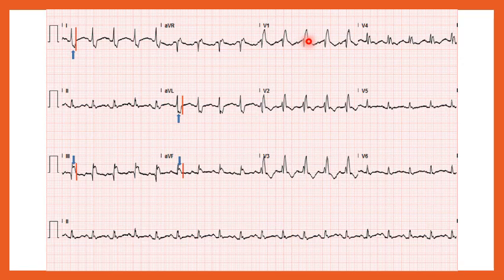And the bend of the QRS, I always call it the J point. That's not my term. That is an accepted term. The J point is the actual junction point between the QRS and the ST segment. I have my laser on it right now. That is the J point, the junction point. So all of this is QRS. The QRS complex looks like 0.16 to 0.18. It's a big QRS. So that then would make us look for a bundle branch block. Would it not? That would definitely make us look for a bundle branch block.